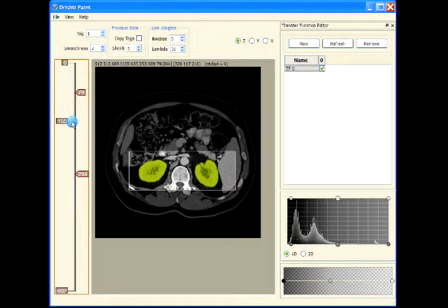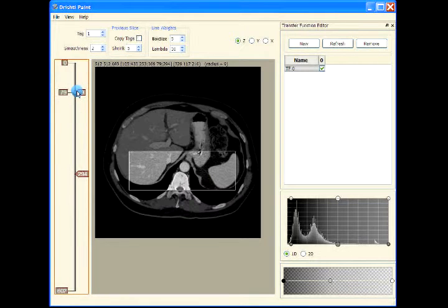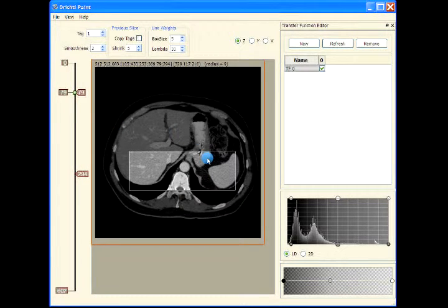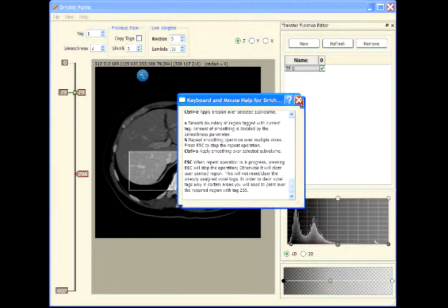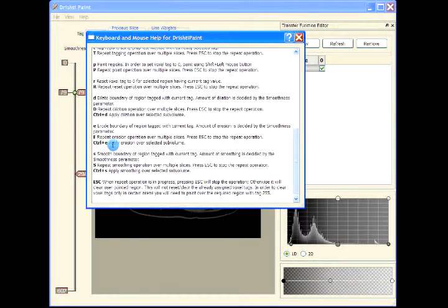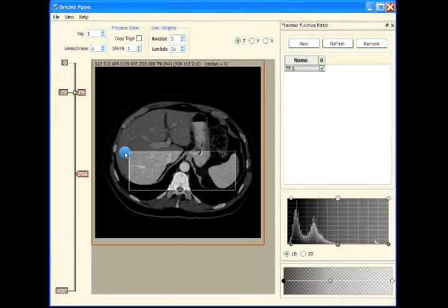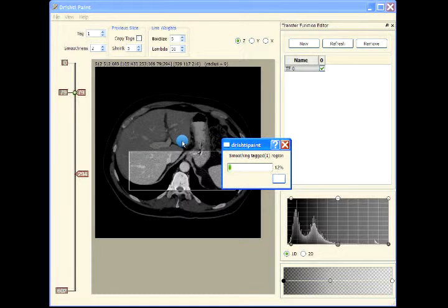Here is the dilated region. Now I'll apply smoothing — Ctrl+S. Ctrl+S will apply the smoothing over the selected volume. If you want to apply smoothing over slices you can press Shift+S, or press Ctrl+S and it will smooth the tagged region by that factor.